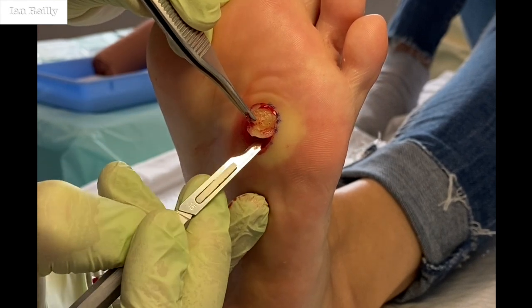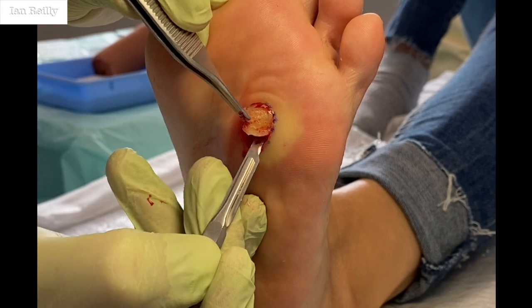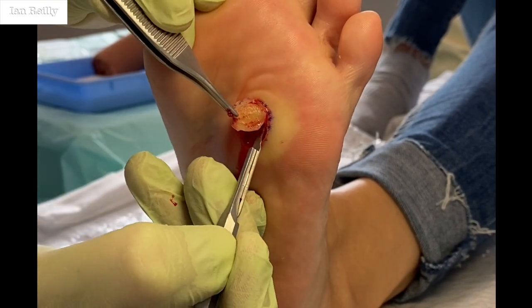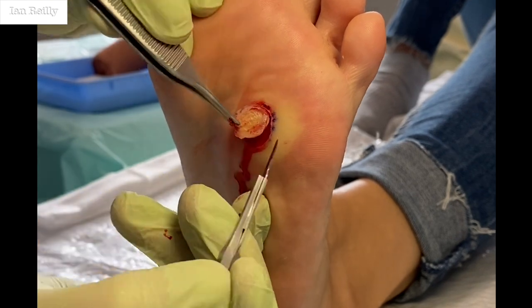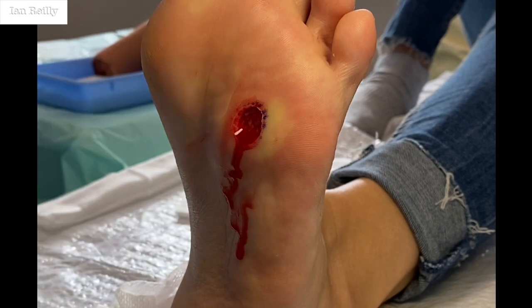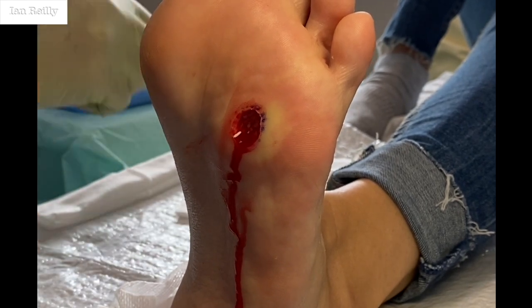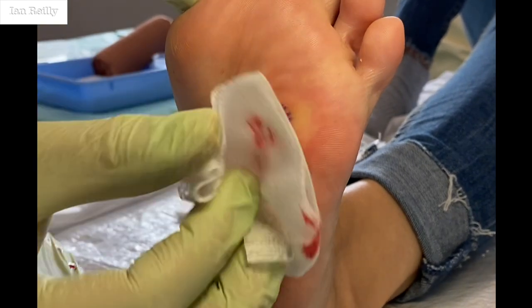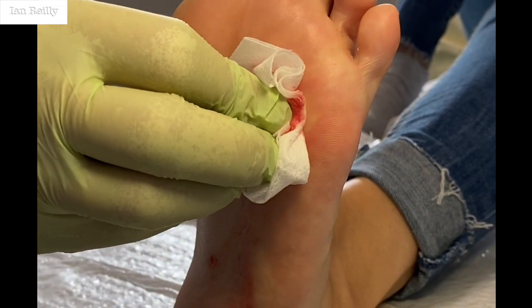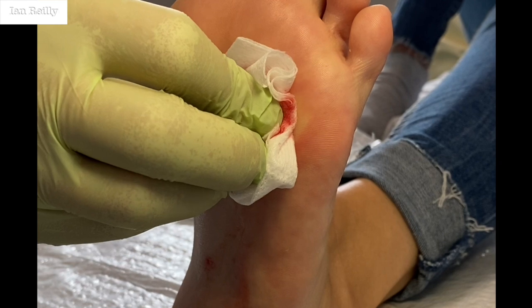So, all the way through — you can see it's quite a deep lesion. It's always much deeper than you think. This goes off to histo and will come back as a verruca I'm sure. That's it all out. You can see quite a hole, but it's good — all out.